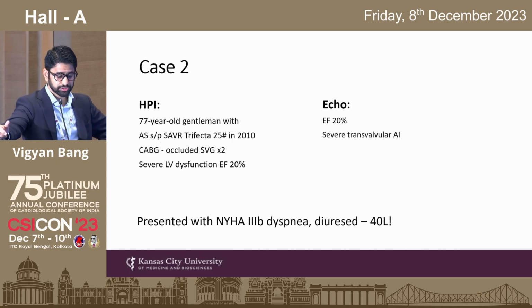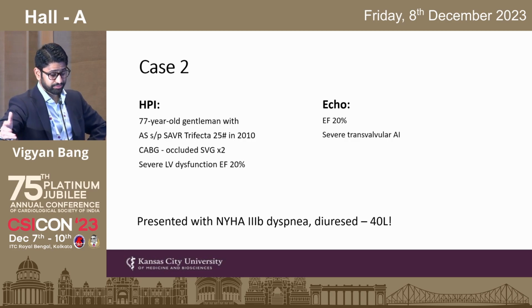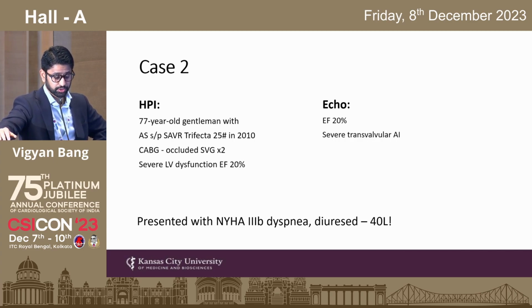We are now seeing so much of this Trifecta failure, and these are some of the toughest valve-in-valve cases we do. He, in fact, outlived the average or median valve performance expectancy for Trifecta, which is about 6 years. So he survived to about 12 years. But he presented with significant shortness of breath, near rest symptoms. He was bloated like a balloon. He got diuresed negative 40 liters.